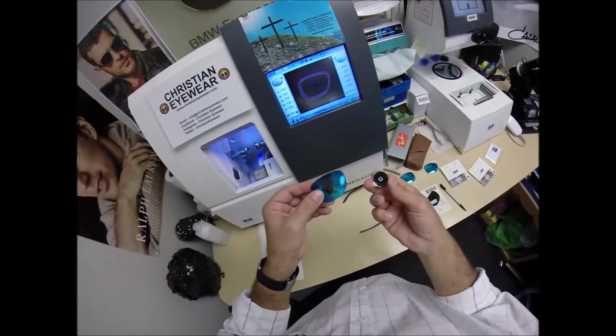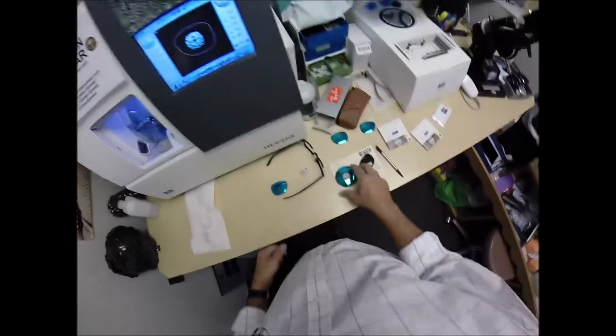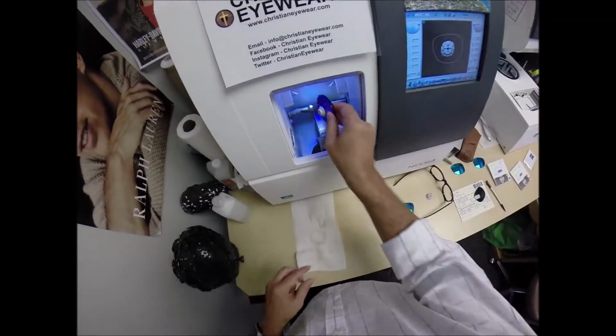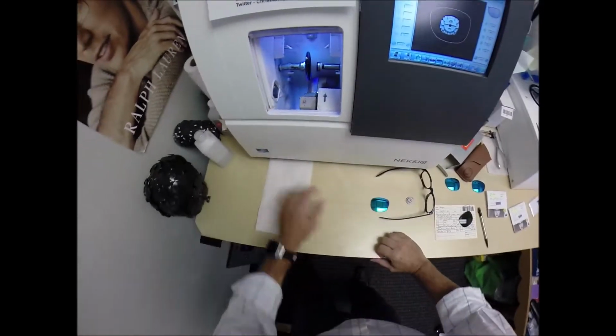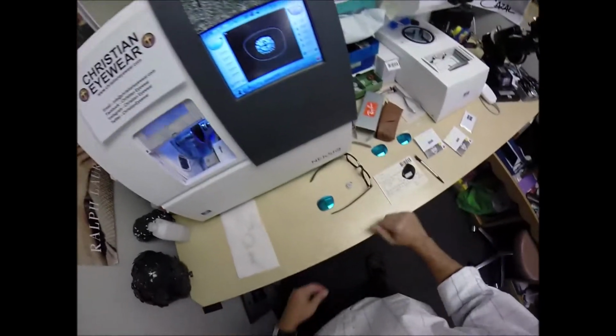Actually, you know what? I'm going to have to go old school because the sticker came off. So flip this over to L. It's still 0.2 millimeter smaller. Place the magnet into the Chuck, the Charles, the Chucky baby, or as I call it, the Jorge. Hit the green start button.